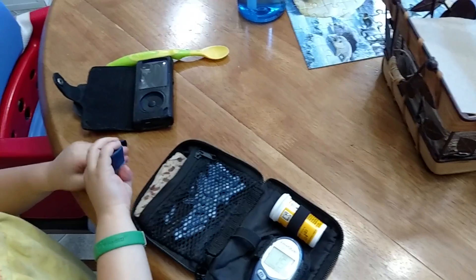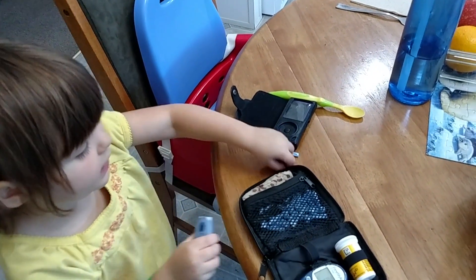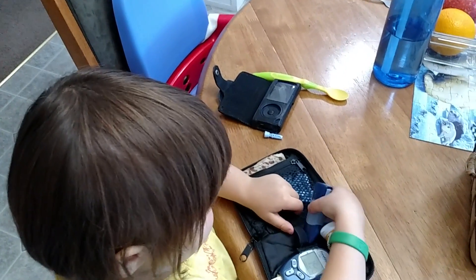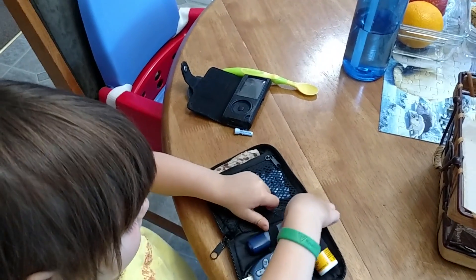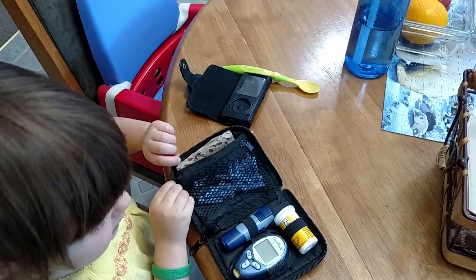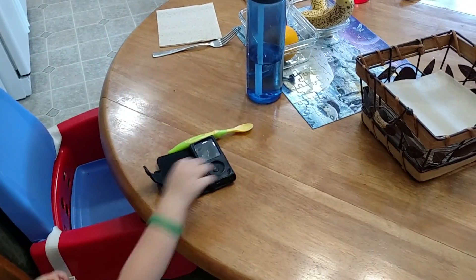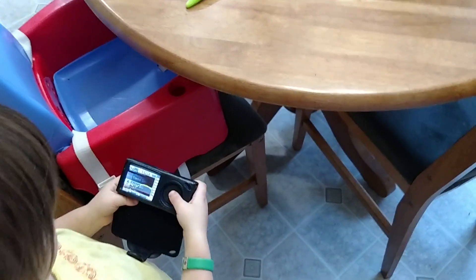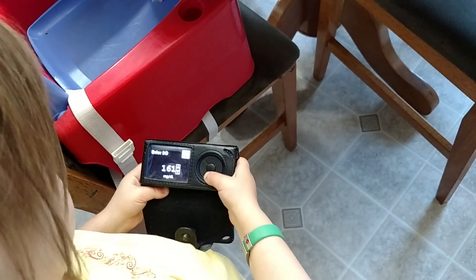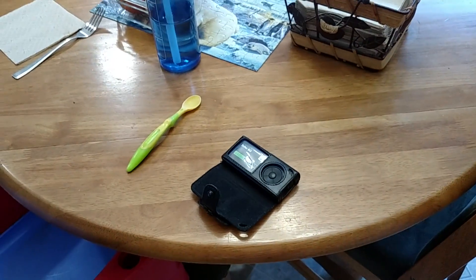And then, what are you gonna do? I put it, and then I throw the test strip and the lancet away. And that's it. What do you have to do with your Dexcom? I gotta enter it in to my Dexcom. Can you show them how to do that? Sure, so now I'm gonna enter it in. This is how. That's it.